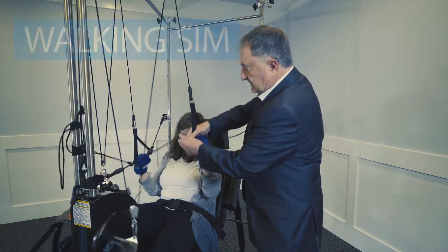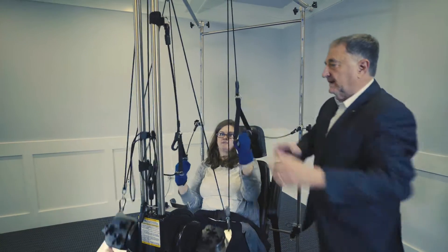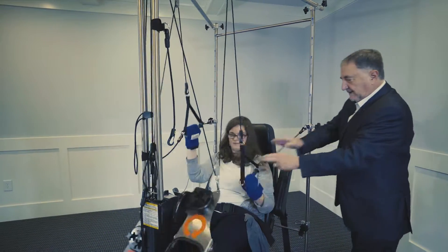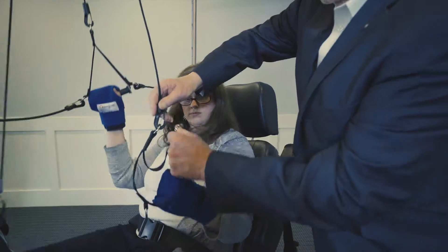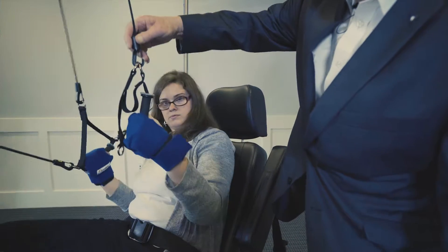The way you do this adjustment is just disconnect it right there and raise this cord up the other way. We'll do the same thing here. See how easy that is to hook? Now her hand's in a walking mode — that's the way you'd walk.